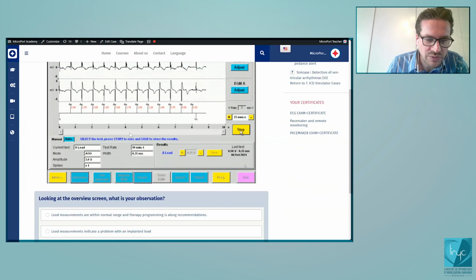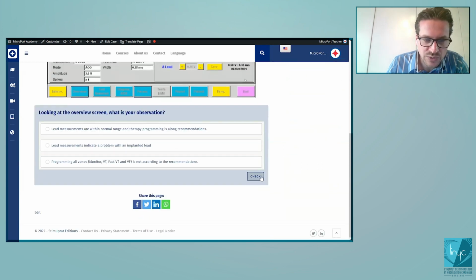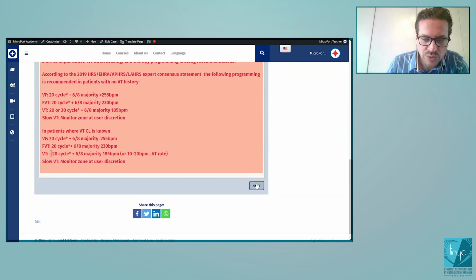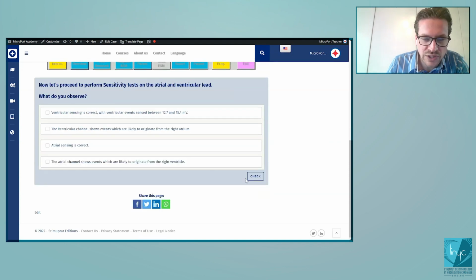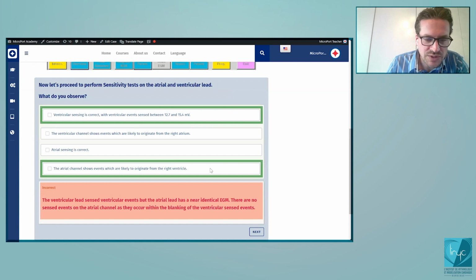So I had to call back this patient to reposition the atrial lead. As you know, it happens sometimes.